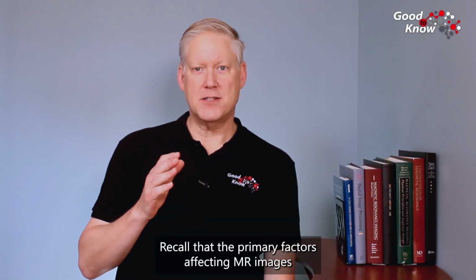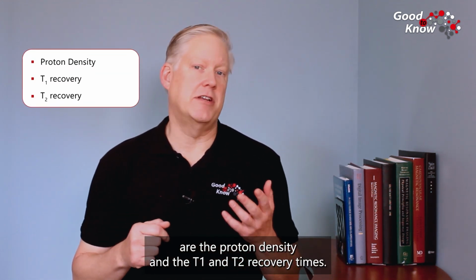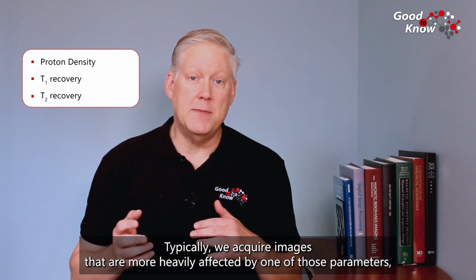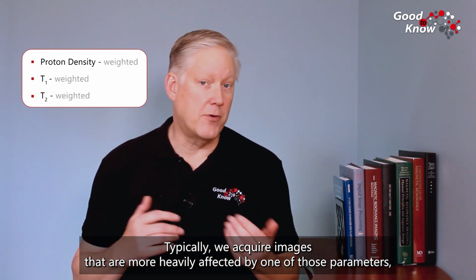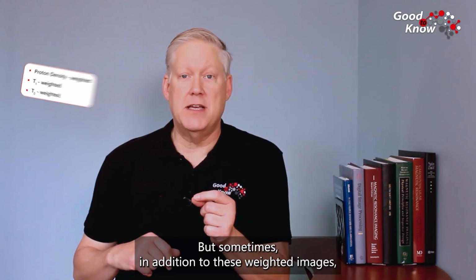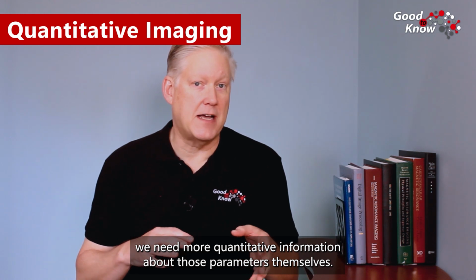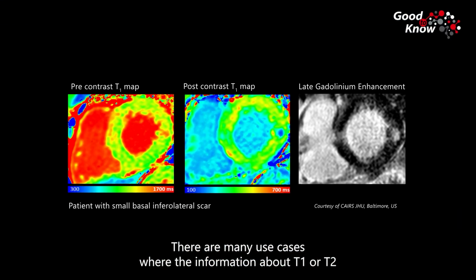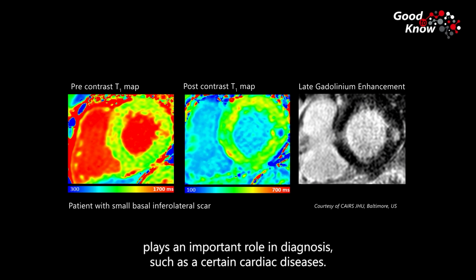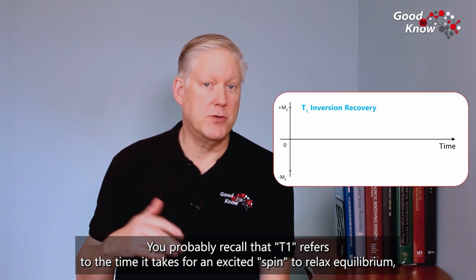Recall that the primary factors affecting MR images are the proton density and the T1 and T2 recovery times. Typically, we acquire images that are more heavily affected by one of those parameters, such as in T1 weighted or T2 weighted imaging. But sometimes, in addition to these weighted images, we need more quantitative information about those parameters themselves. There are many use cases where the information about T1 or T2 plays an important role in diagnosis, such as certain cardiac diseases.